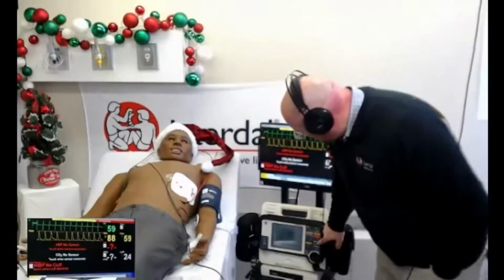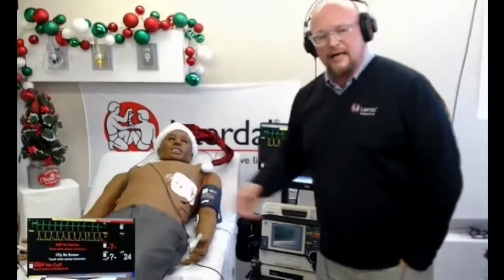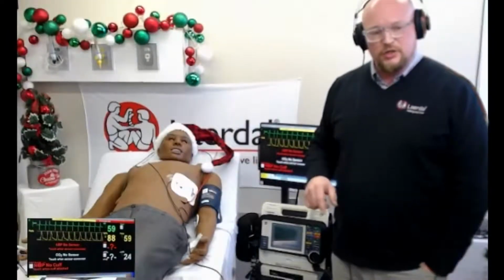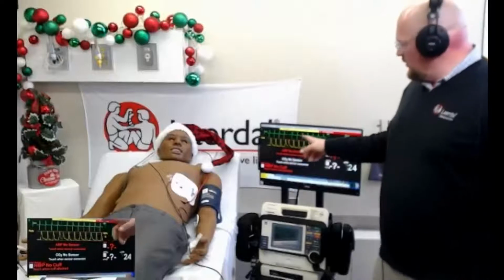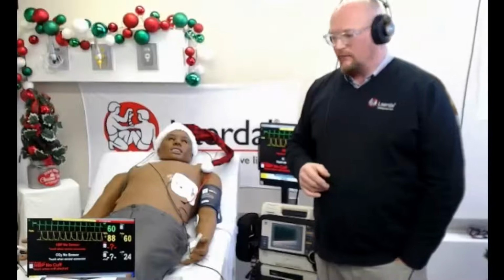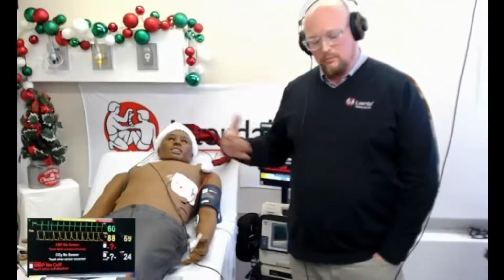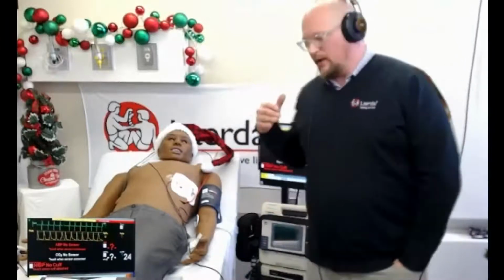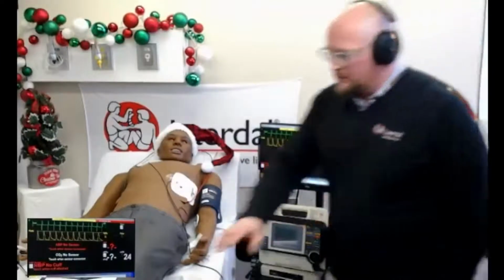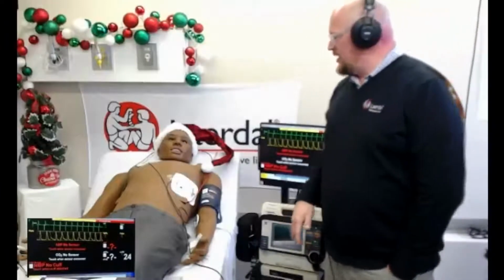But I'm going to go ahead and turn off that pacer. You can see the pacer spikes. I have electrical capture. I can go back now and check for mechanical capture. This mannequin will actually do that, so that once we go over the threshold of the pacing capture, the femoral pulse will start to respond as per what the pacer is set at. So now let's take you out of that, my friend, and we're going back to the initial state.